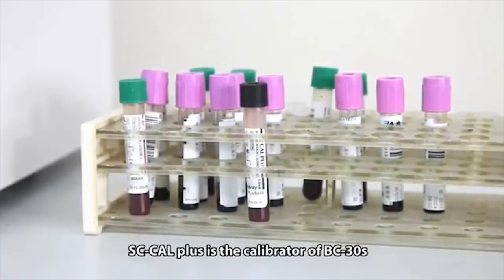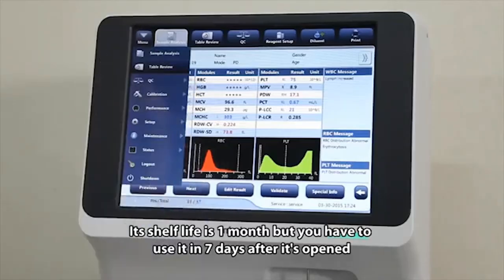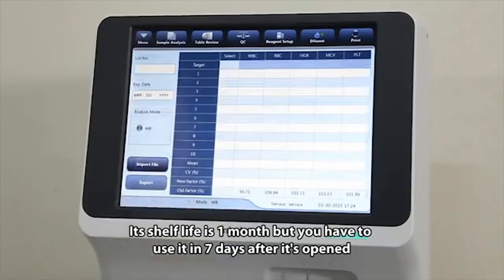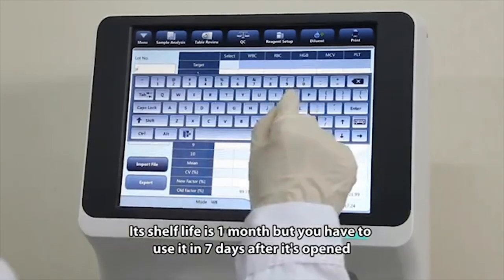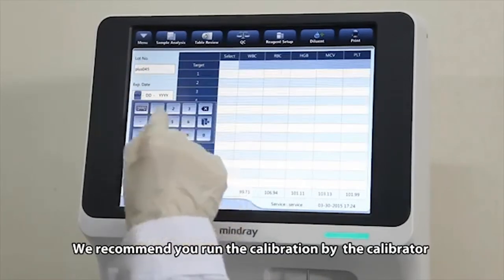SC Cal Plus is the calibrator of BC30S. Its shelf life is 1 month, but you have to use it in 7 days after it's opened. We recommend you run the calibration by the calibrator.